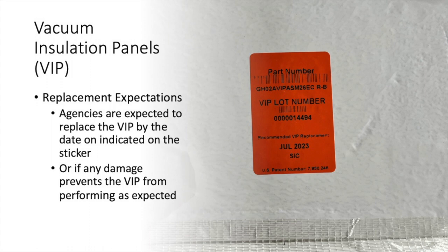If you find any damage during your daily inspection, it is the Regional Whole Blood Committee's expectation that your agency replaces your VIP. Your VIP will also be embossed with a sticker that has a recommended replacement date on it. It is the Regional Whole Blood Committee's expectation that agencies replace their VIPs by the date indicated on the sticker.